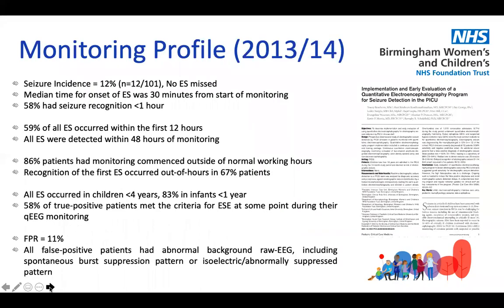So in 2013, just at the end of that, we looked at our study population over a 14-month period. The link to the article is in the Dropbox. And we found that around 12% of our population are having seizures in intensive care.